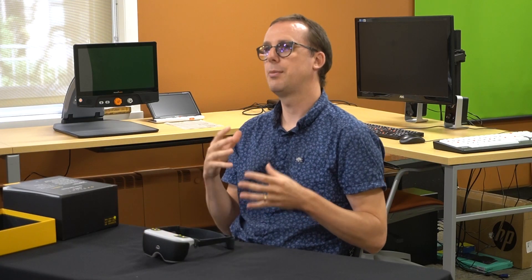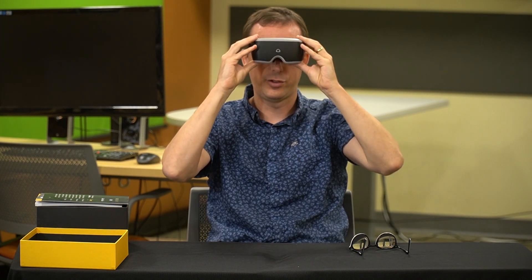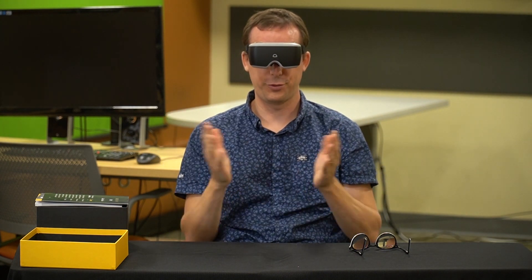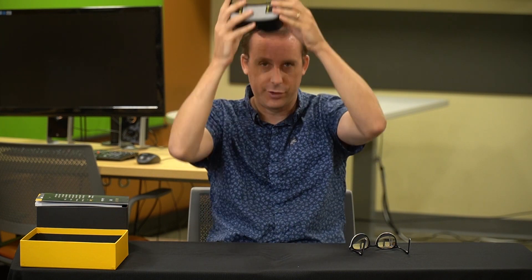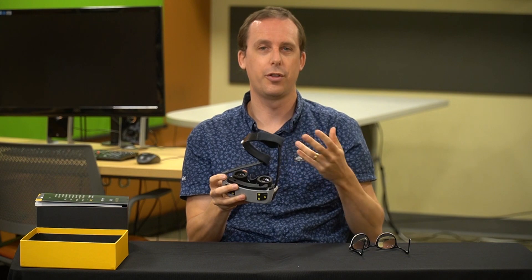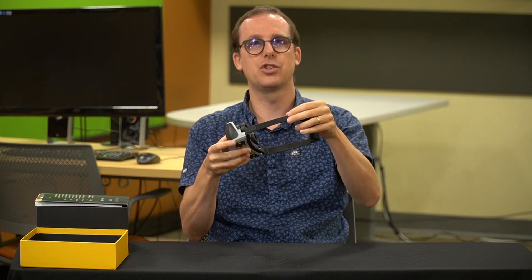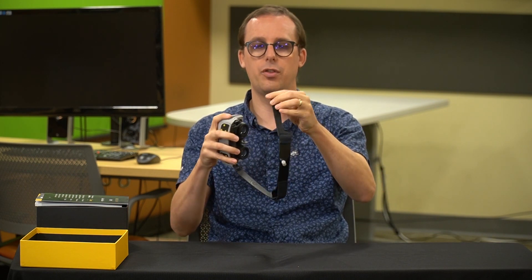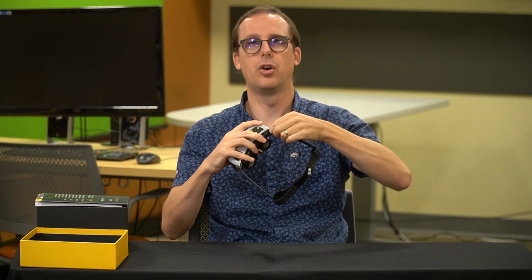I want to put this headset on to demonstrate what it looks like while you're wearing it. It is definitely one of the smaller headsets on the market, so maybe it's a little more attractive than some of the others. There is a Velcro strap on the back which allows you to adjust for the size of your head. The arms are actually removable — when you get the headset they are not on, you have to put them on yourself, but they just hook on and it's super easy to get them on and off.